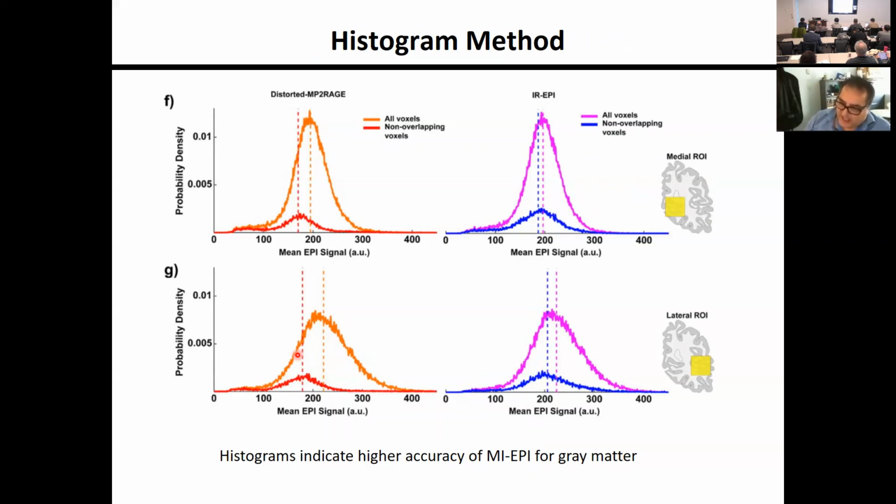So I would not claim this is a proof, but it makes a consistent story, because the inversion recovery EPI has the same distortions, so the accuracy of the registration should be better than applying some processes which might not be optimal, and applying some smoothing might actually result in error.